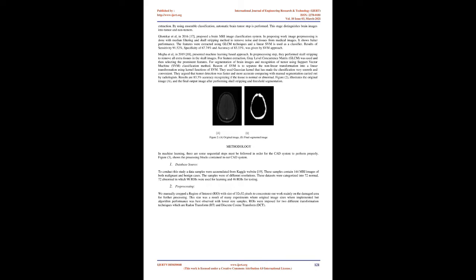F. Louise 10 suggested a methodology where a framework is built to classify and detect the tumor. The proposed method passed through stages: pre-processing, segmentation, masking, feature extraction, and classification. Pre-processing of images was done through a median filter and a Gaussian high-pass filter.